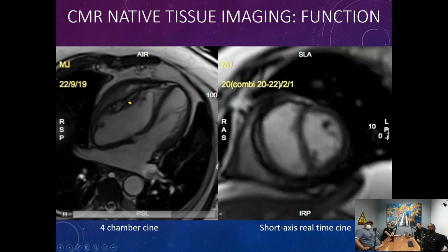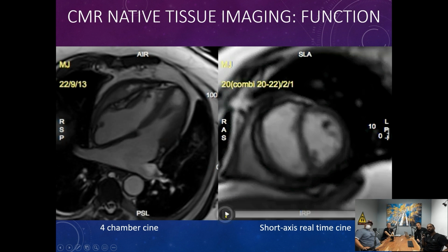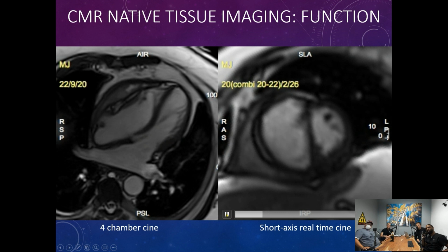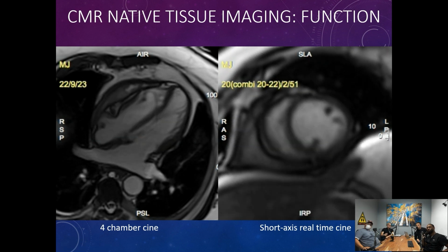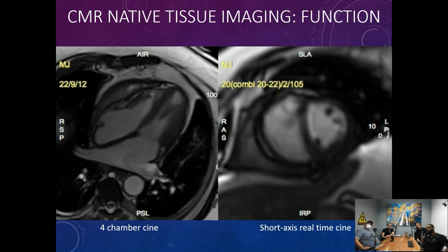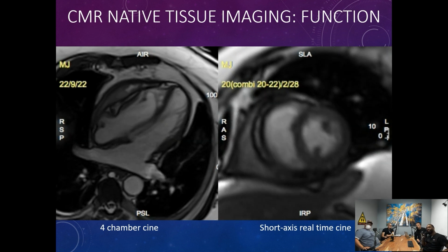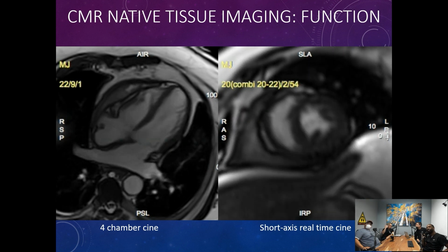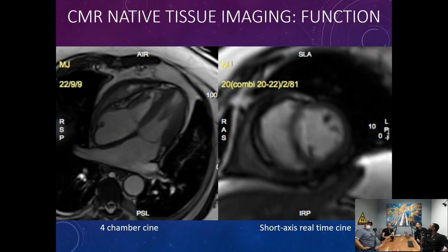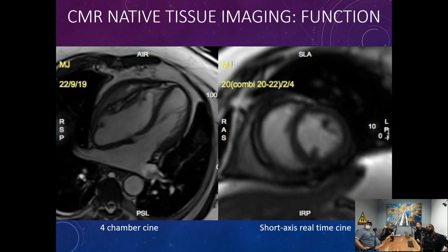Now, this is an image that's done during breath hold. That's why the image is so crisp and so nice. So the patient's not breathing. But then a derivative of that is to do real-time imaging, where we say to the patient, go ahead, breathe. So it exemplifies the limitations and the trade-offs you have in cine imaging. You see that we've traded off spatial precision for temporal resolution. Right. So we acquire more images. They are a little blurrier.